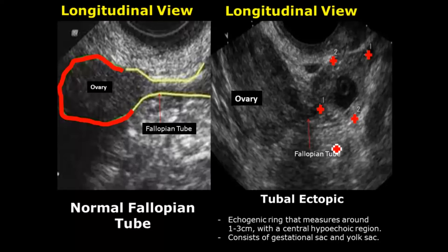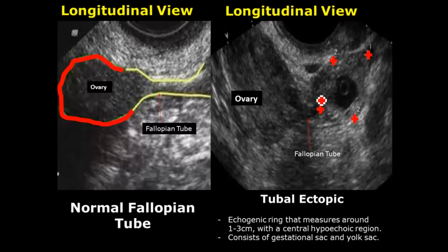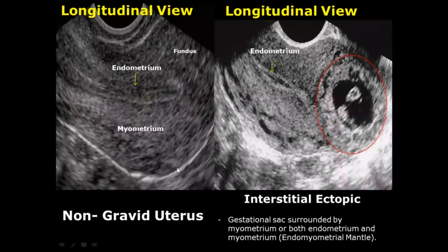Ectopic pregnancies occur outside the uterine cavity. Based on their location, there are different types. The most common is the tubal ectopic, which occurs in the fallopian tubes. We can locate the fallopian tubes by first finding the ovary and identifying the connection leading to the fallopian tube. There is a gestational sac inside the fallopian tube, confirming a tubal ectopic pregnancy.